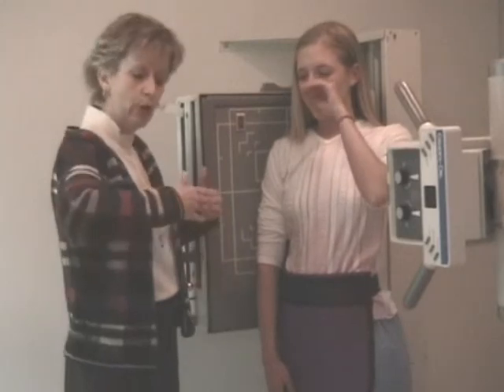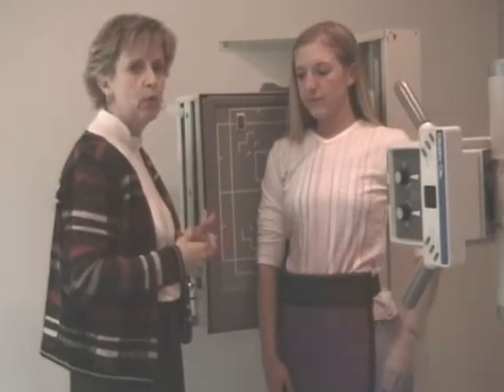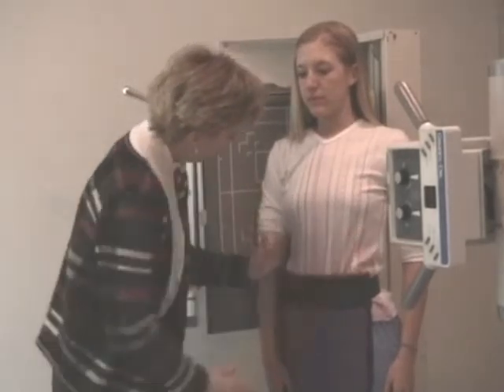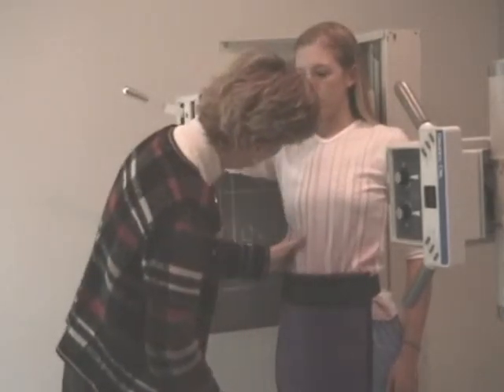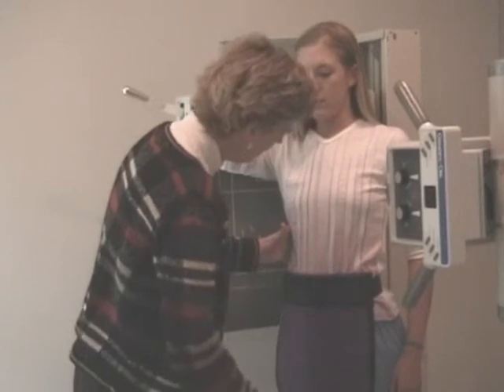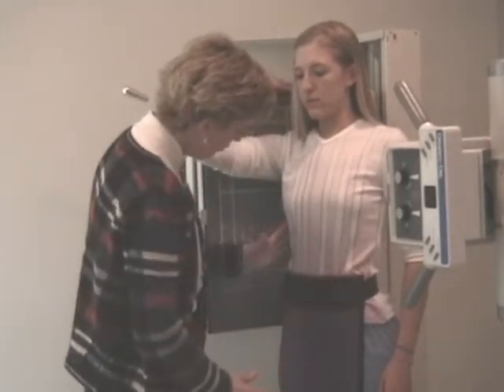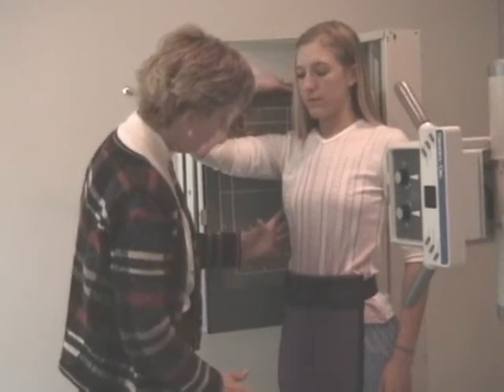Patients who are bigger and rounder will need less degree of obliquity, and patients who are narrow and more oval will need more degree of obliquity. So I've put Kristen at a 45, and I'm coming in and I'm looking at her lateral ribs, and they're not really laid out for me, so I'm going to oblique her just a little bit more. See how I'm getting my fingers more parallel? That's what I want to do.